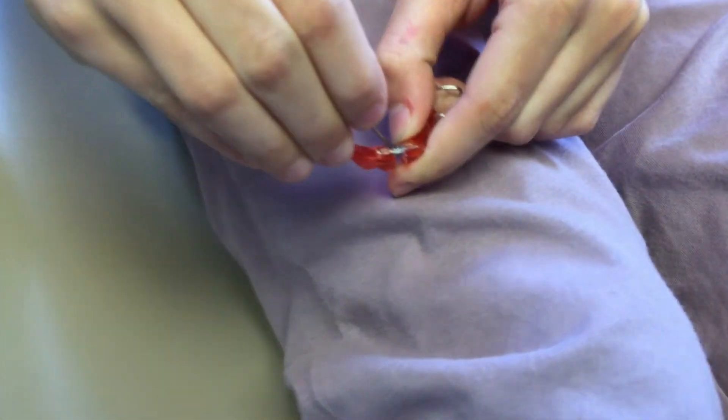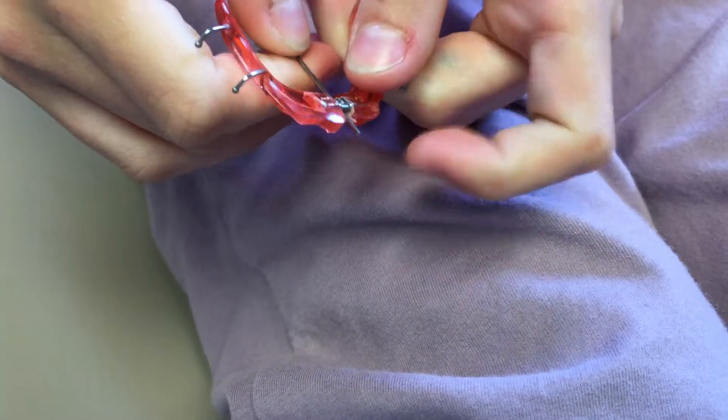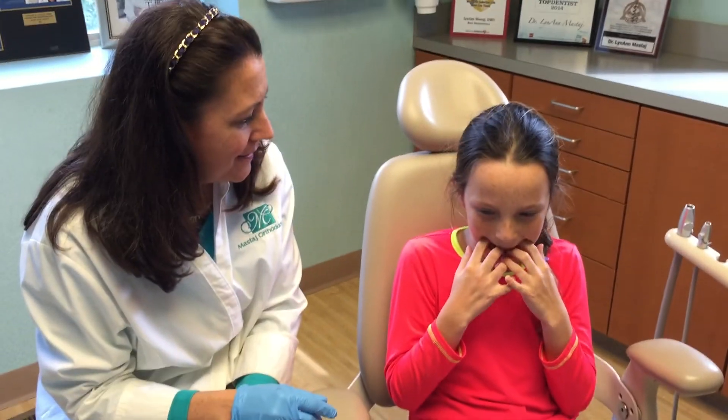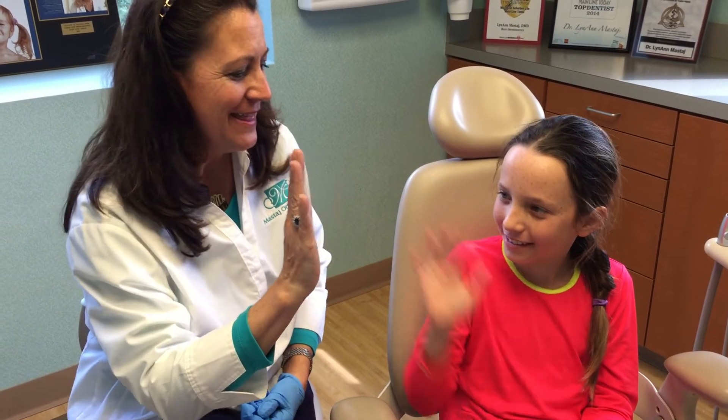Zoe does this about once a week and pushes the key down. Excellent, Zoe. Now put it in your mouth. Feels a little bit tighter, doesn't it? Great job. Awesome. Those are retainers and the Schwartz expander.